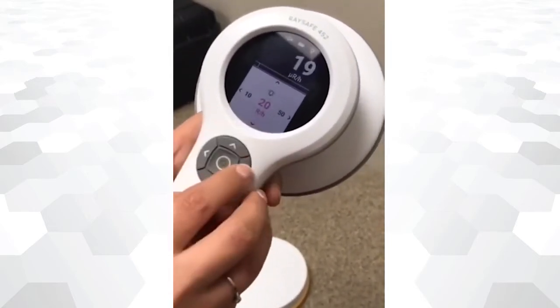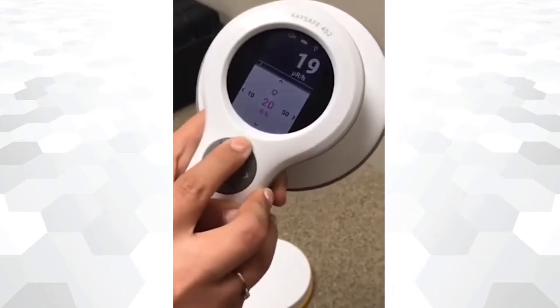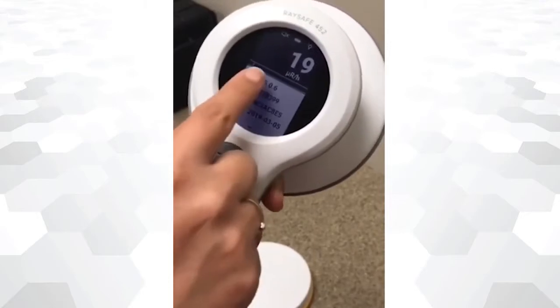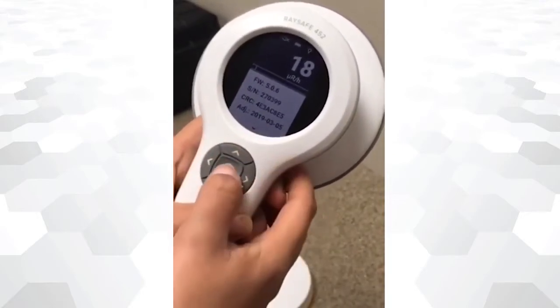A radiation limit can be selected for your measurement by going into alarm settings. RACE-A 452 device information can be accessed through this screen. The final row shows the calibration date.